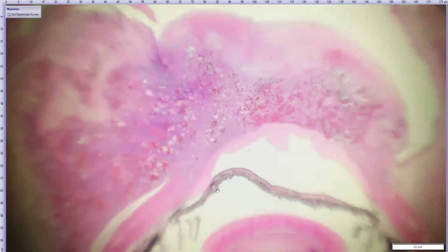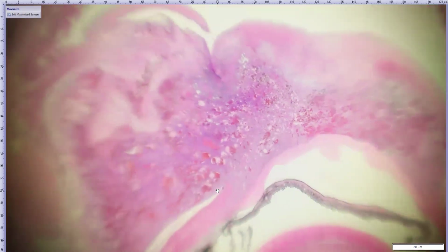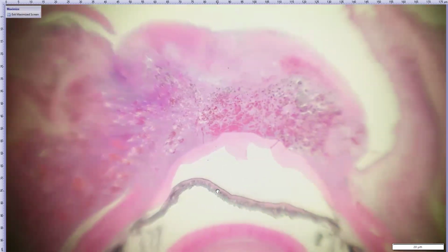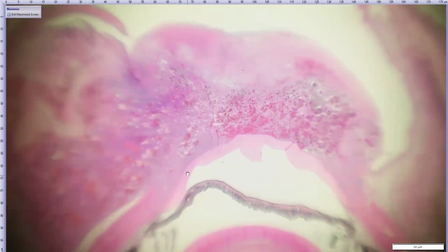There, I can do subgross maybe. Here we go. We've got a lot of red spaces and a lot of purple again that make up this big ocular surface mass. And again, just like in the gross image, the deep corneal stroma seems relatively unconcerned amidst the chaos.